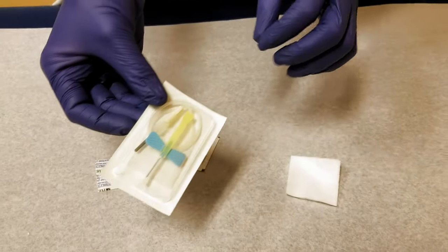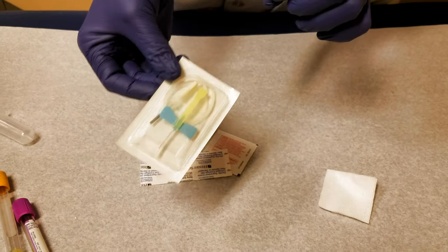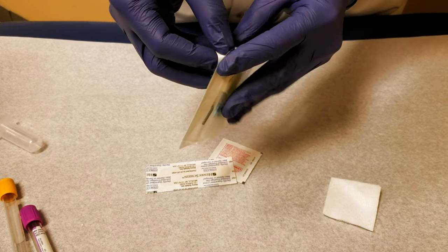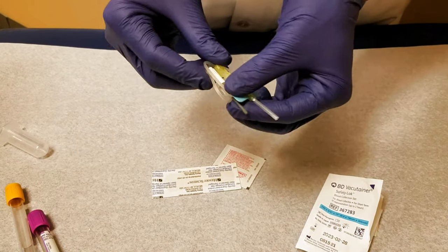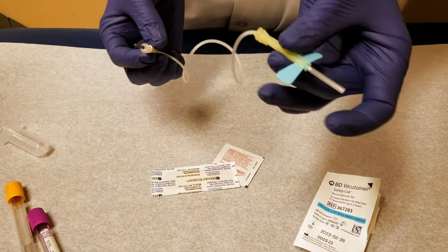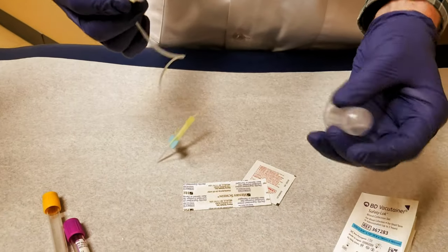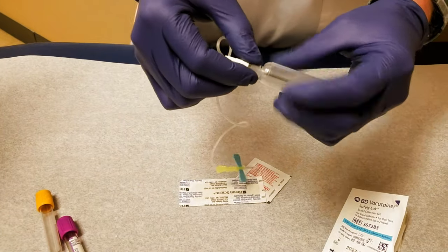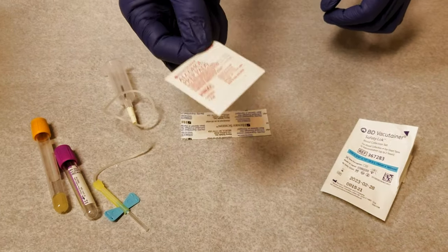This is a needle with a butterfly needle attached to it with some tubing. When you're learning how to draw blood, these are very easy to learn with because you can see the blood and what's happening. This is the part that goes in the person; this is the part that goes in your needle holder. You put it in, attach it like that, and it's ready to go.